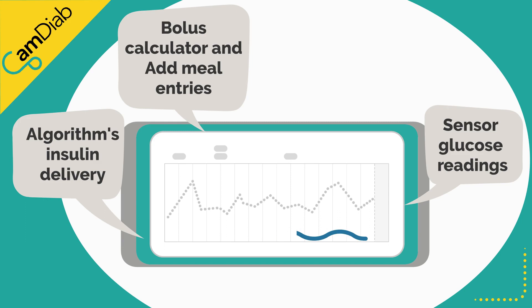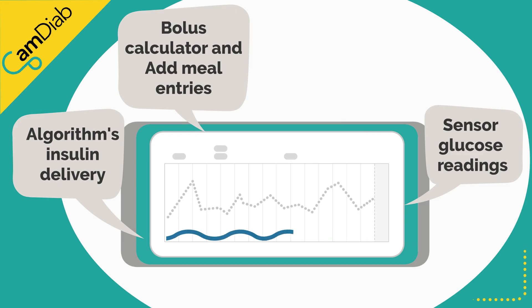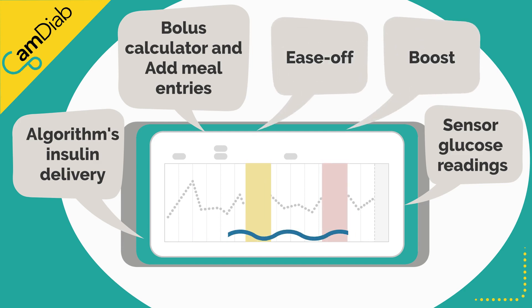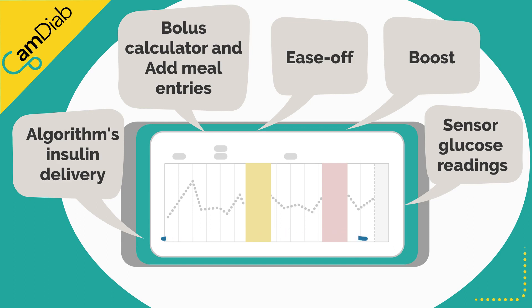You can see the algorithm's insulin delivery in blue at the bottom of the graph. If auto mode is not working, the pump's pre-programmed basal will be shown in blue. Times when boost and ease off have been used are also shown. You can pinch or scroll the graph to see more data.